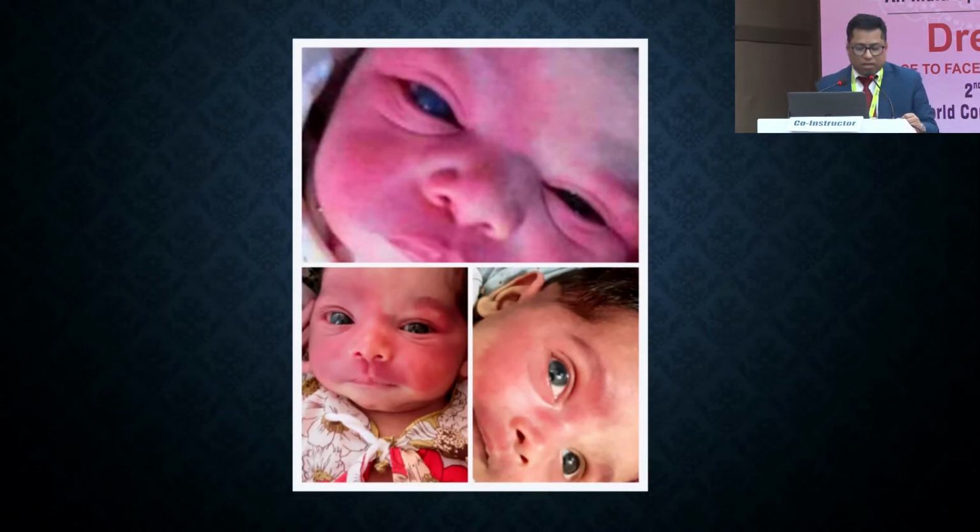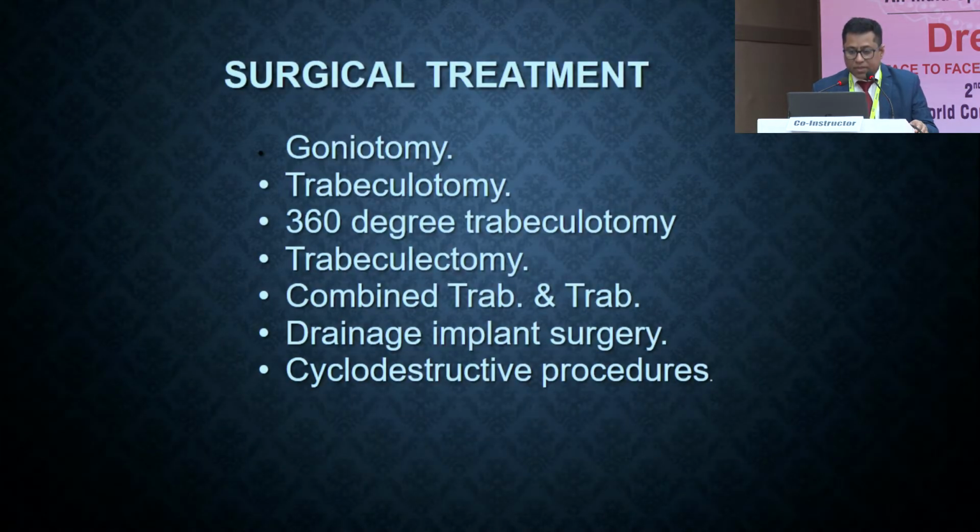So this is one case where the patient presented with a very enlarged cornea, and the second one is the third postoperative day, and right downwards, left downwards is the seventh postoperative day.